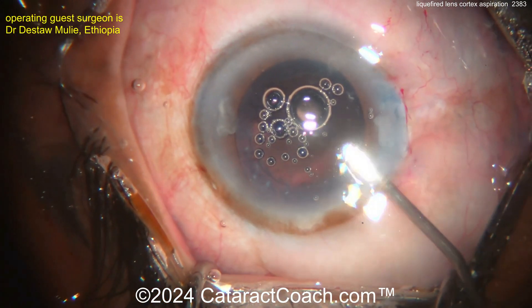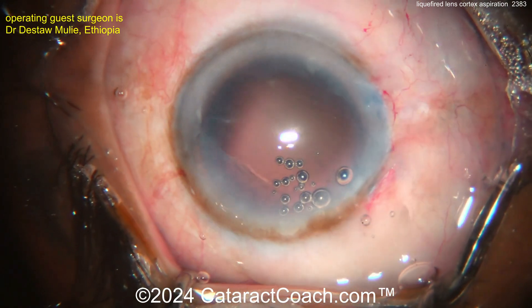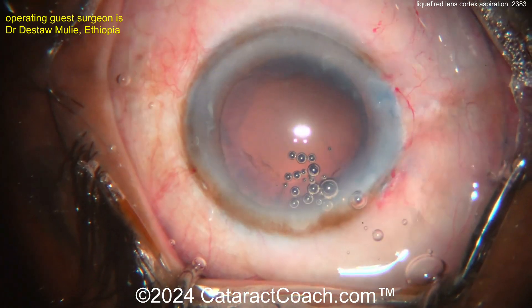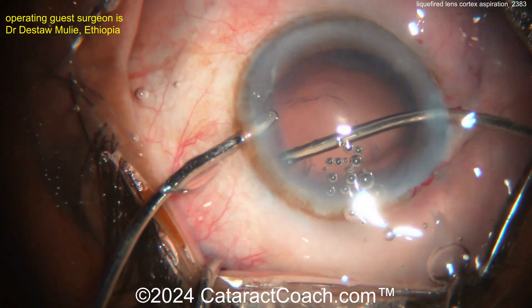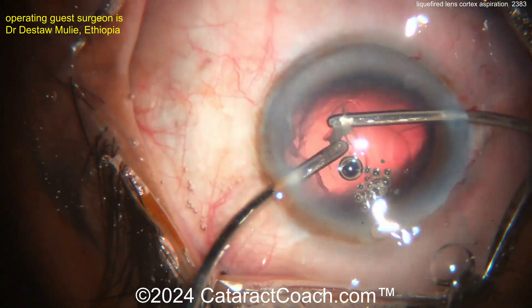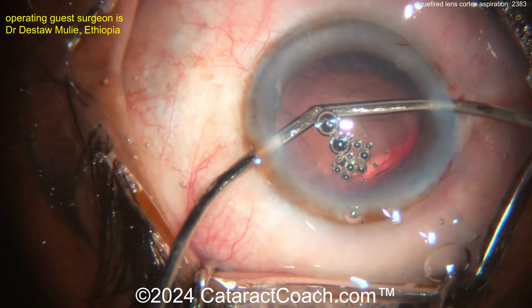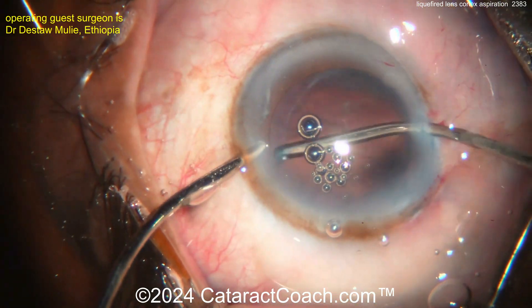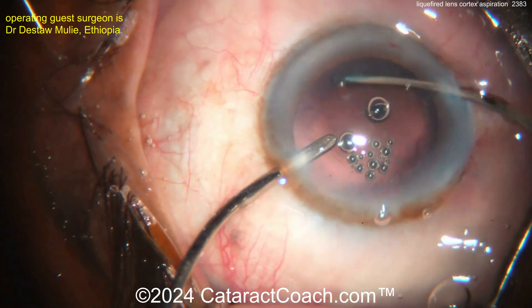Probably very little cortex in the back here. Switching hands — there's some maybe on the left side or superiorly. More viscoelastic to push out any pieces. Looks like the viscoelastic is HPMC — hydroxypropyl methylcellulose — a very low viscosity, easy to use and store viscoelastic. Last little piece — there's a small nuclear chip you can push into the I/A probe port.